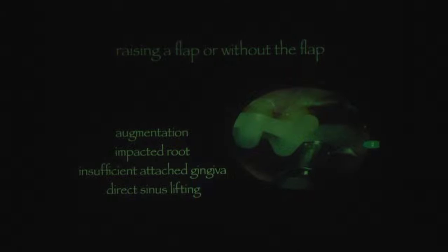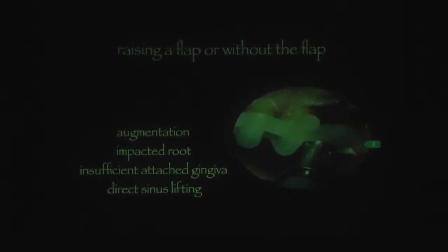Raising the flap or without: if you don't want to see the root, then do not open the flap.